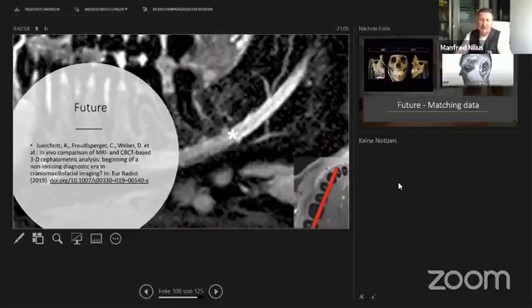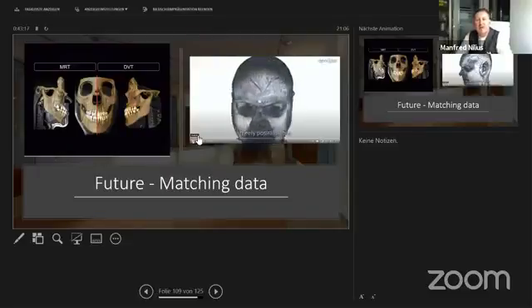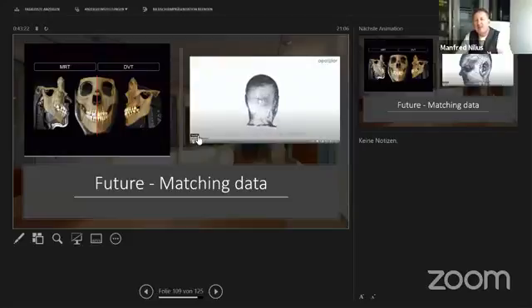One goal is that we can see the nerve and that we will not damage it, because our future navigational systems will detect the nerve by themselves. There is one publication from Jürchert and Freudlsperger from Germany, from Heidelberg University. They also make cephalometric analysis by MRT. And the next step will be to have data matched from MRT, or magnetic resonance tomography, with DVT.